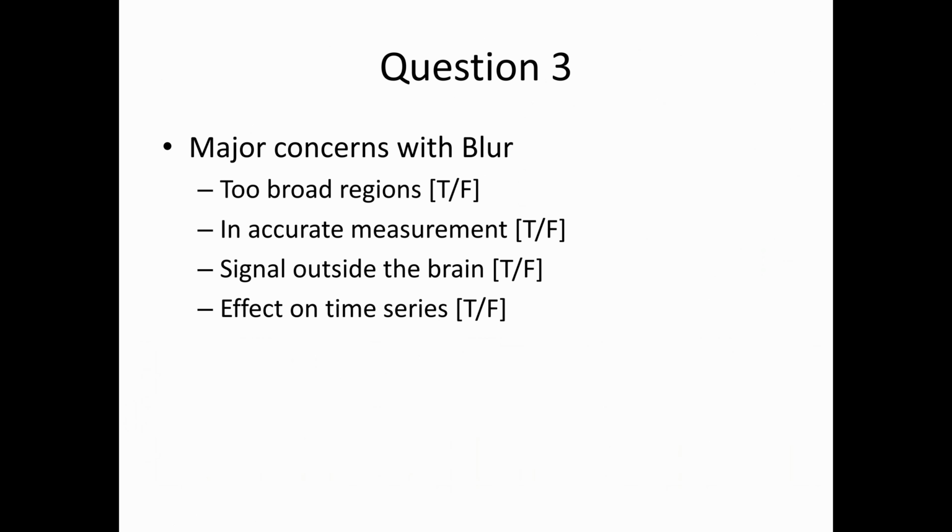Yeah, I think the other effect, obviously, that you get into is the fact that even these methods, and AFNI doesn't, I'm not sure if it has it in yet, but the fact that the blur varies spatially, right? A lot of these algorithms assume one blur, but as you see, for the posterior cingulate cortex, the blur is very different there than in the rest of the brain. So if you apply the same full width half maximum, you're going to be wrong in certain brain regions, which inflates your chance of finding things in the PCC. Right.